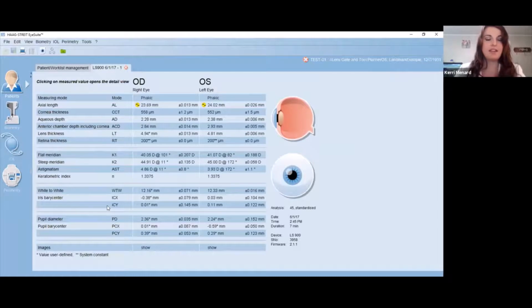All right, so in regards to pupils, we do also recommend having a conversation with your physicians to determine if they are not reviewing this pupillometry data. It may save you time by not having to review and adjust these measurements if they're not looking at them either. Pupillometry is like a sunroof in a car. It can be a nice feature, but it's not necessary to make your vehicle drive.